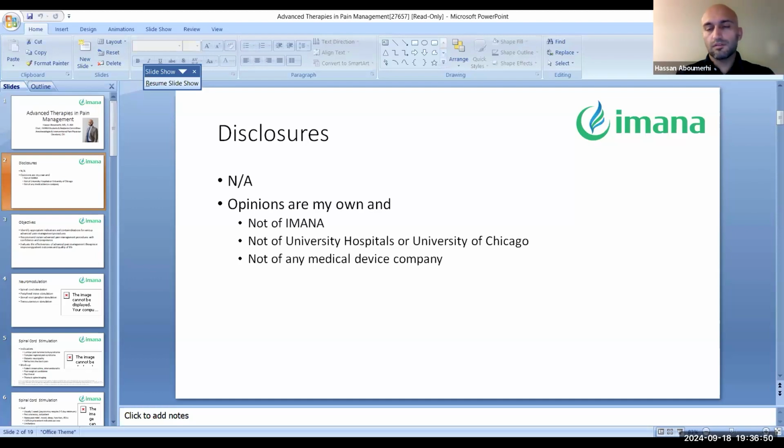But insurance also requires a psychological evaluation for these patients, mainly to make sure that they don't have any underlying mental health issue that could basically prevent them really from improving no matter what sort of therapy you might provide, especially in a therapy like this, which takes commitment. It's an implant, it's expensive. But what I tell patients is, just like going to buy a nice car and going for a test drive first before making that big decision, you can do a trial.